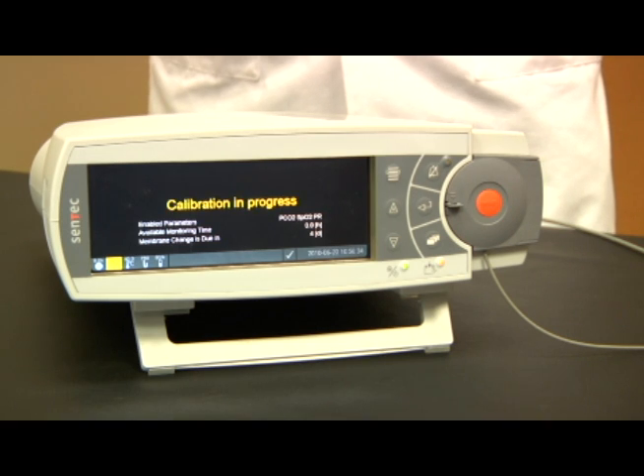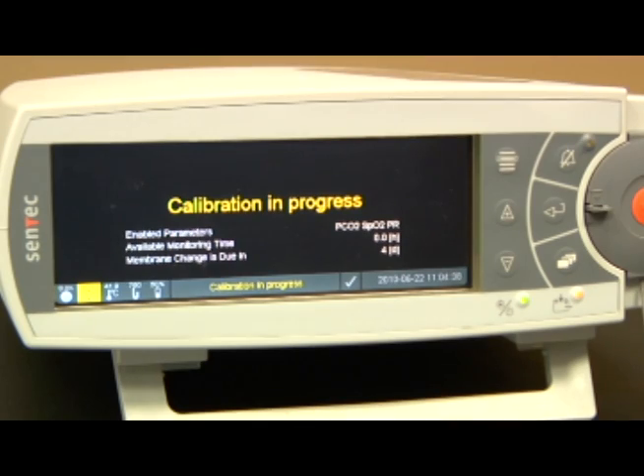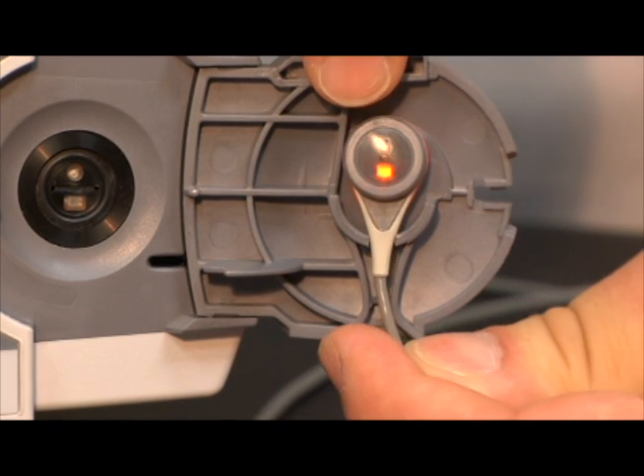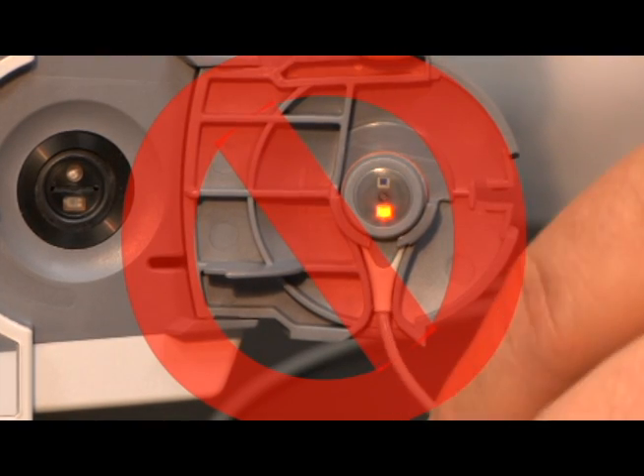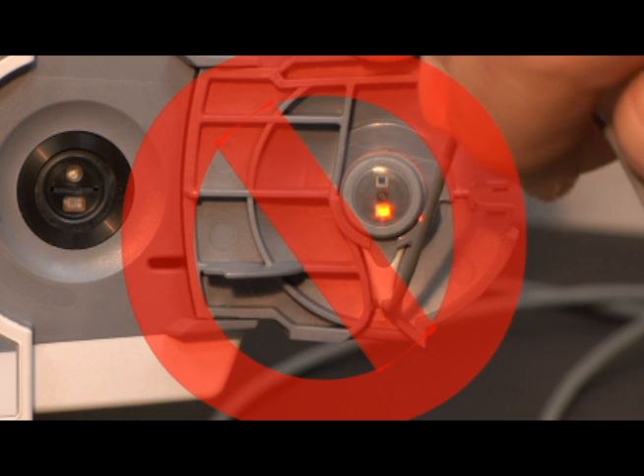Under normal circumstances, the calibration should be accomplished in 3 to 5 minutes. If a calibration goes beyond 11 minutes, please check the sensor membrane status and/or the condition of the docking station. Remove the sensor by lifting up from the strain relief. Never pull the sensor from the carriage as this may cause damage to the sensor cable and housing.